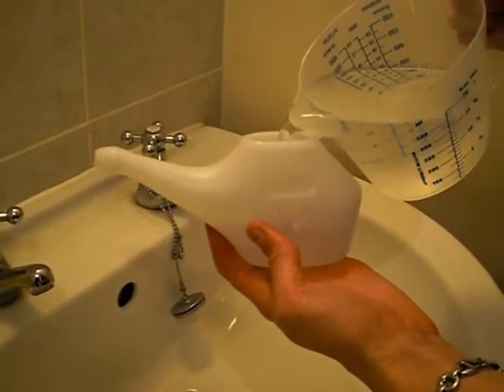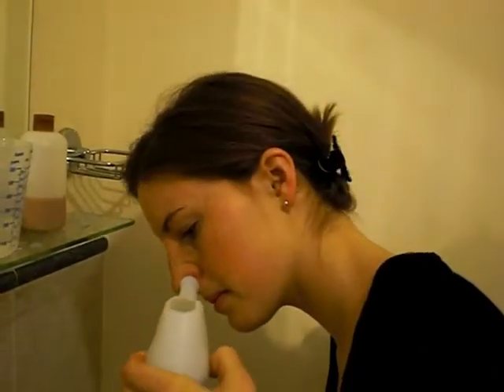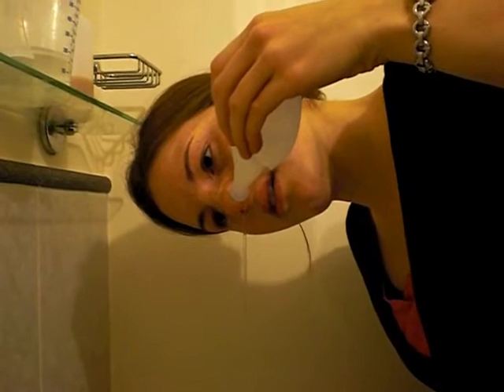Pour 150ml of the solution into your neti pot. Lean over the sink and tilt your head. Place the spout of the neti pot gently into the upper nostril. Keeping your mouth open, tilt the neti pot so that the solution pours into the upper nostril and flows out of the lower nostril.